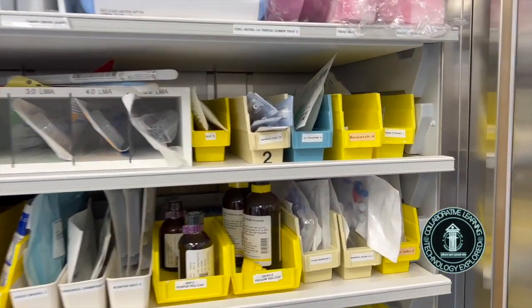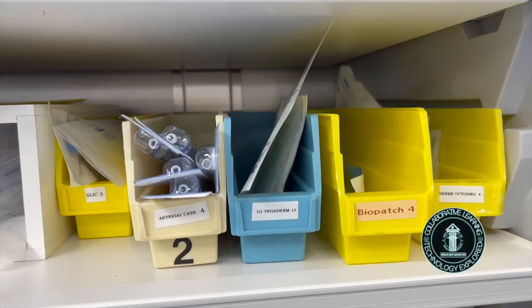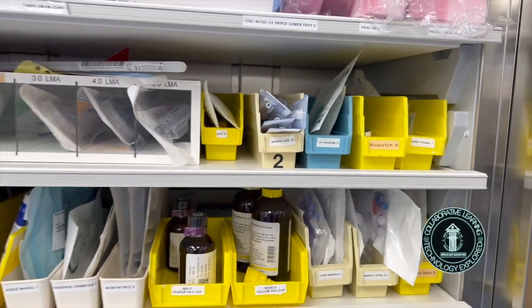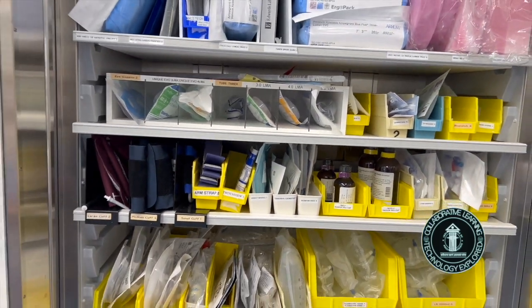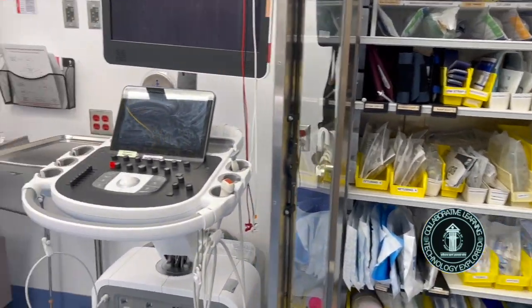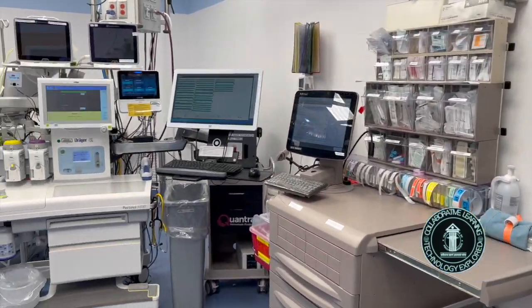And you can see here the biopatches, which we use routinely to prevent infection through these central lines. And we also put those over the arterial lines. Thank you. And you can see here the central stations.